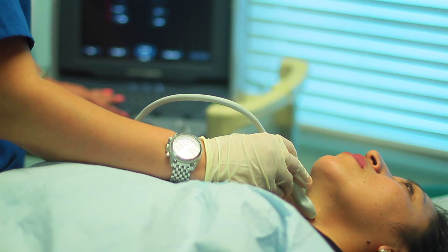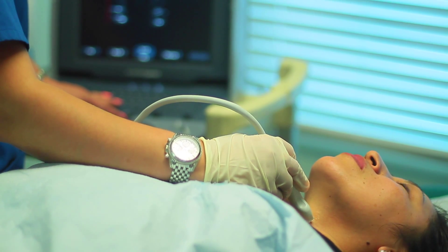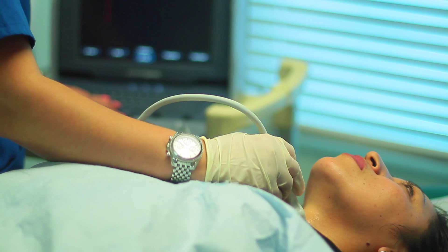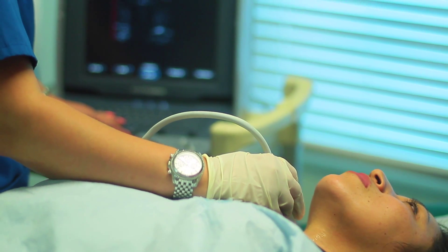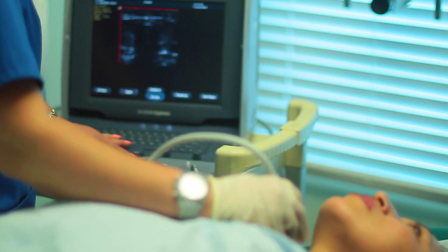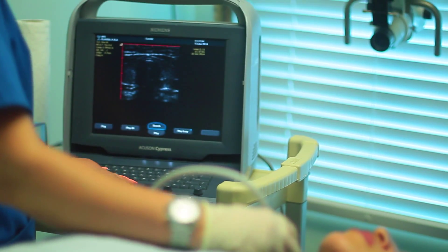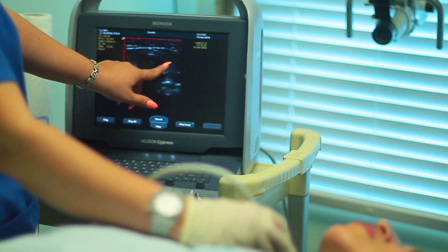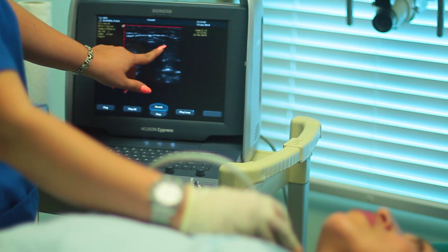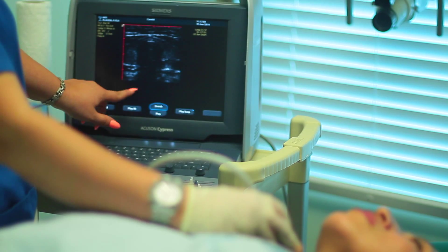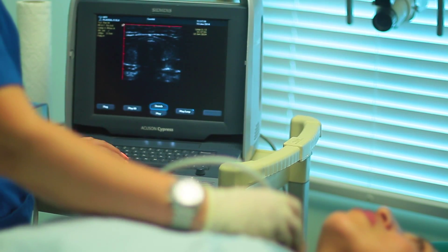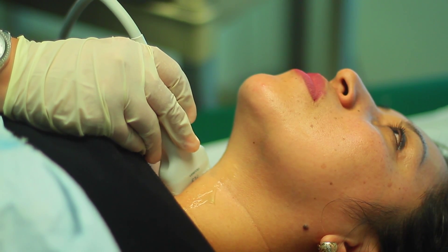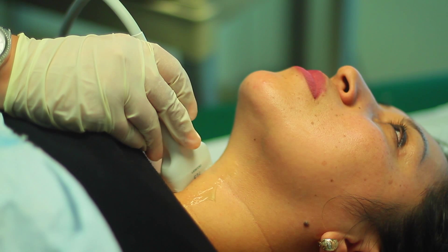Layla is now performing a thyroid ultrasound. This is a safe, non-invasive procedure where the ultrasound wand is swept over the patient's neck gently in sagittal and transverse planes to image the entire thyroid gland.